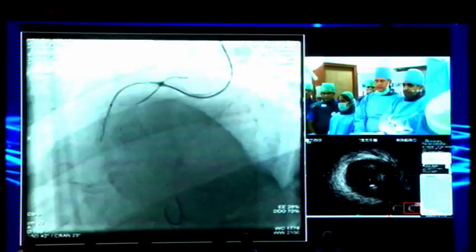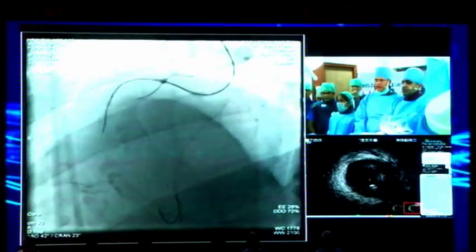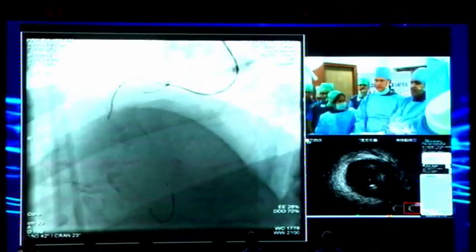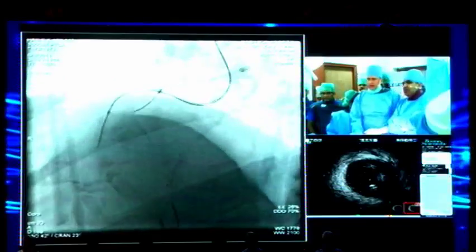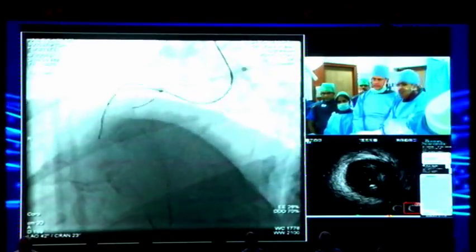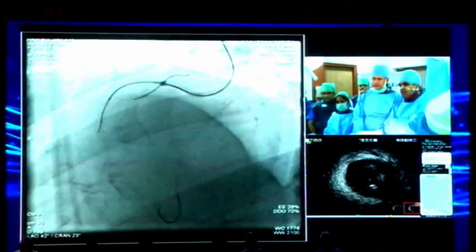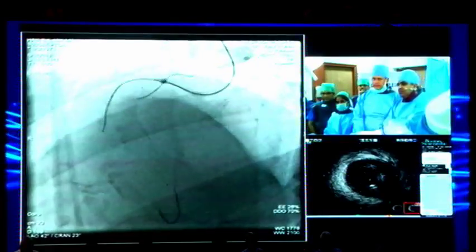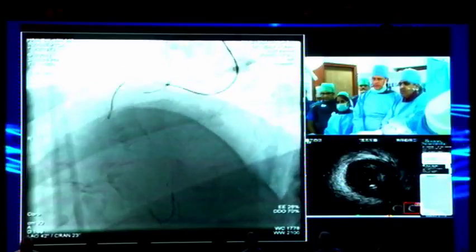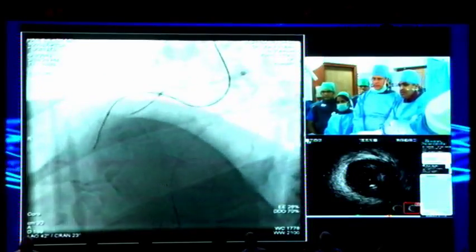What support catheter did you use in this? Yeah, we use a Finecross microcatheter, 135. Do you have any preference in these in-stent CTOs? Usually you don't use Crusade or Corsair wires in the in-stent occlusion because sometimes the Crusade gets stuck. So I prefer to use a Finecross. It's more slippery and we can avoid the microcatheter getting stuck in the stent.